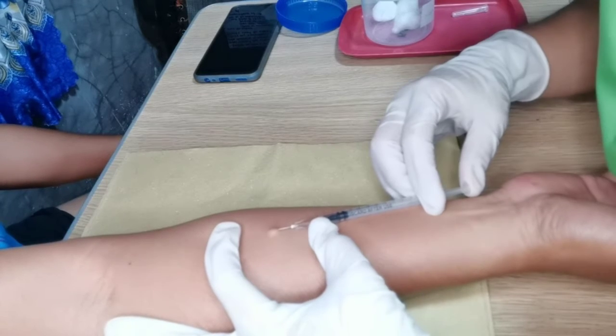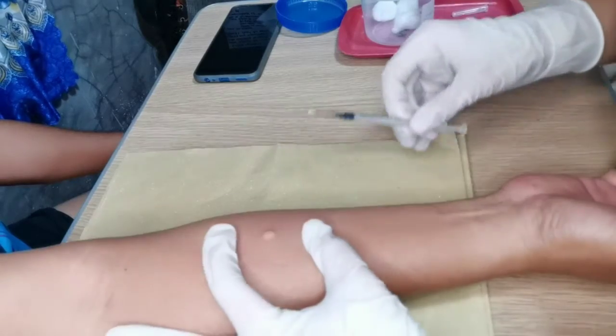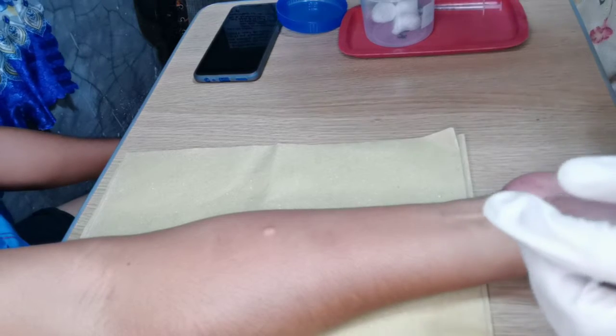Once the needle is in place, steady the lower end of the syringe. Slide your dominant hand to the edge of the plunger. Withdraw the needle quickly at the same angle that it was inserted.